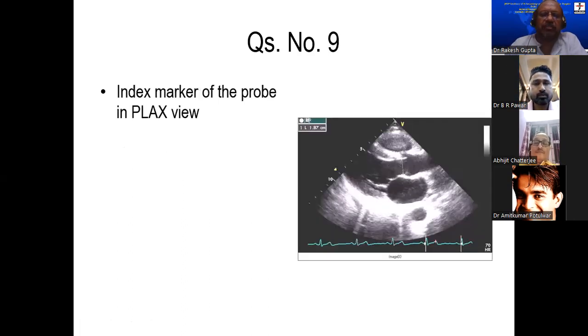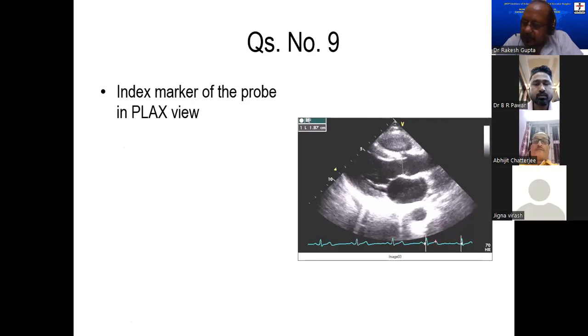This is Mrs. Jigna Vignesh. Good evening, sir. Good evening, Jigna. Since you are doing echocardiography, where do we measure LVOT diameter? LVOT diameter. At aortic root, 2 centimeter away from the aortic root.